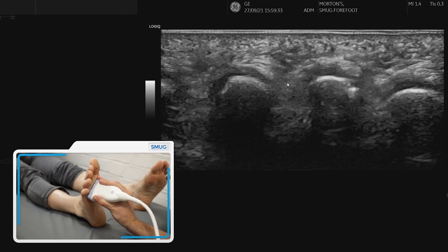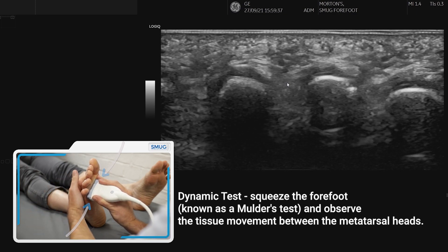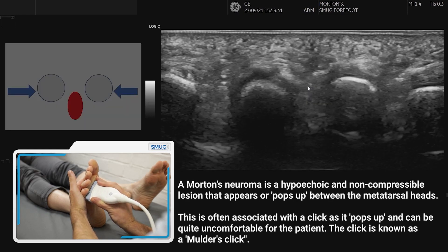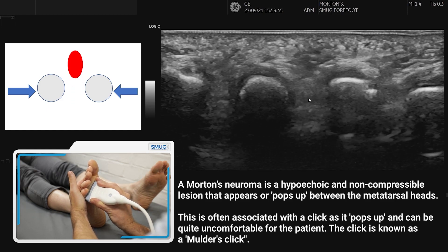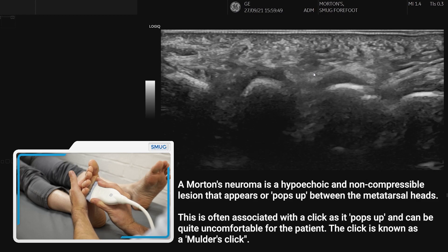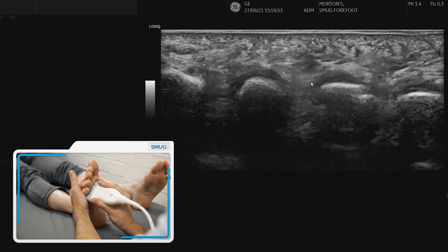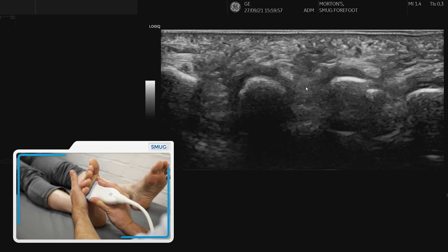Now we're going to do a dynamic manoeuvre similar to when you do a Mulder's manoeuvre to look for a Mulder's click. If we just compress, we're looking for that tissue that comes out between the two metatarsals. If it's a neuroma then it's going to be hypoechoic and non-compressible, and often you will also feel an associated click — and often the patients will feel that too.